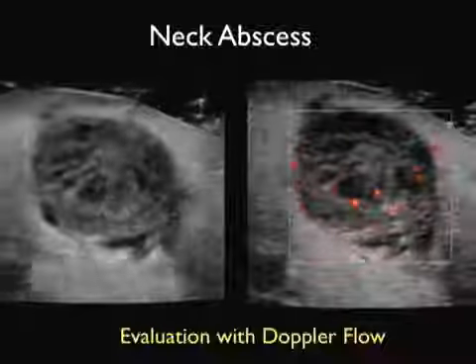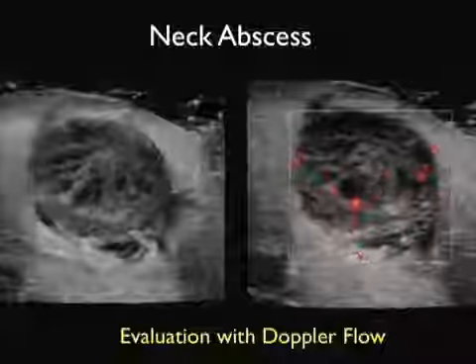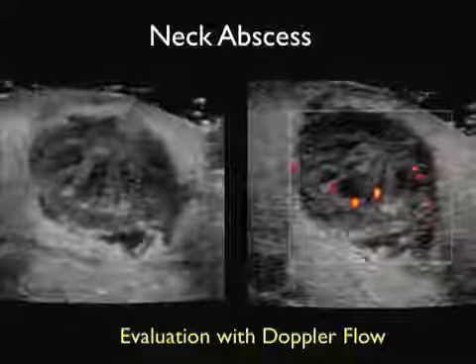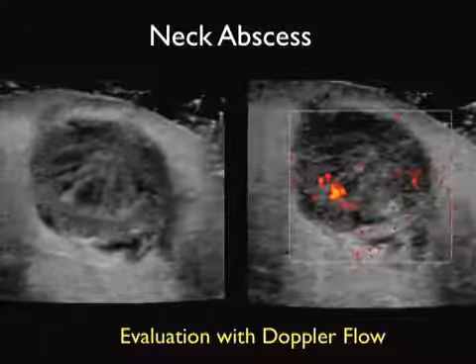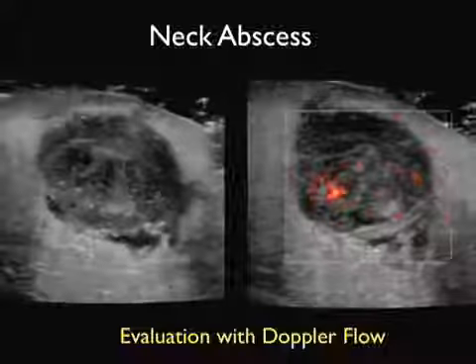Notice that while there's speckling areas of vascular flow, this is actually an abscess cavity and not a vascular structure. So it would be safe to perform an incision and drainage into this area in the emergency department, albeit preferably by an ENT surgeon if one is available. But we can see here that there's no large vascular structures immediately adjacent to the pus ball, so we could get into that pretty easily with a small nick of a knife.